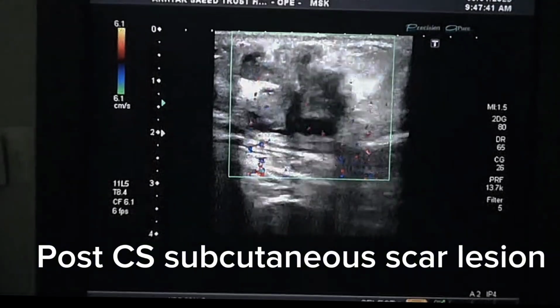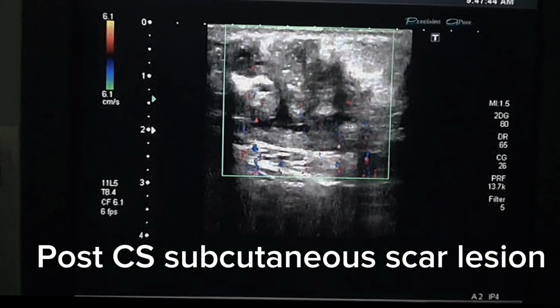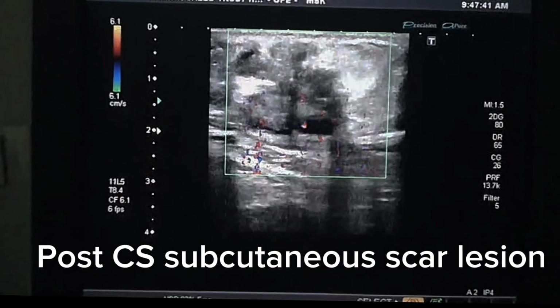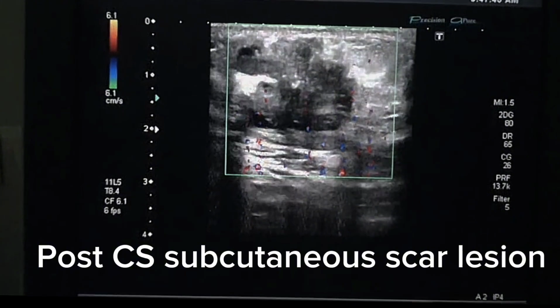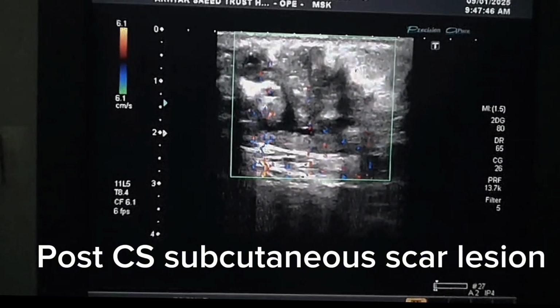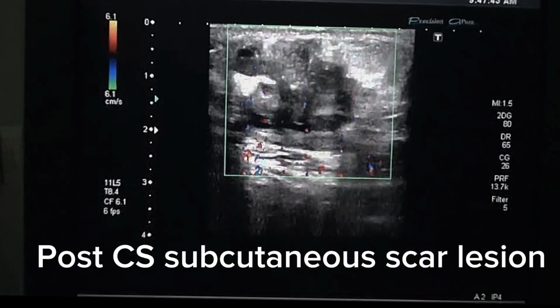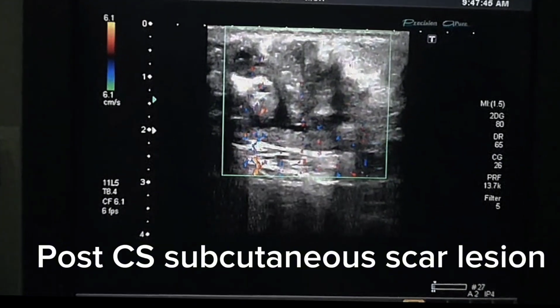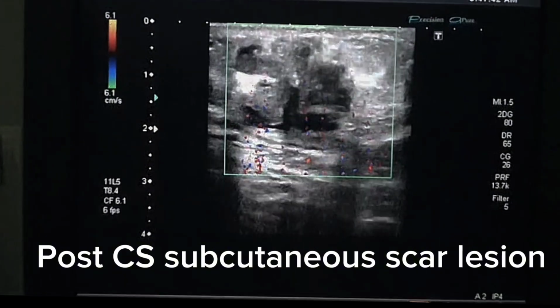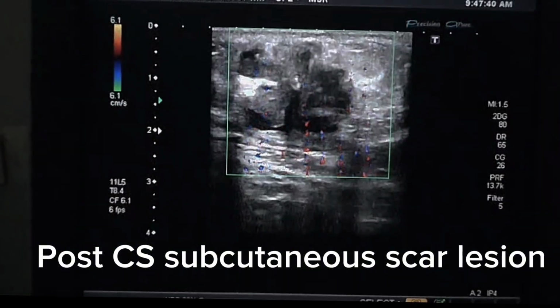Foreign body reaction can also occur in such cases. The cause is retained surgical material like gauze or sponge. Ultrasound shows echogenic mass with shadowing, sometimes with surrounding fluid collection. Clinical features are chronic non-healing wound, pain, and discharge. Management is surgical removal. Further investigation through Doppler ultrasound, culture and sensitivity, MRI if needed, complete blood count, C-reactive proteins for further evaluation. What is the management approach?